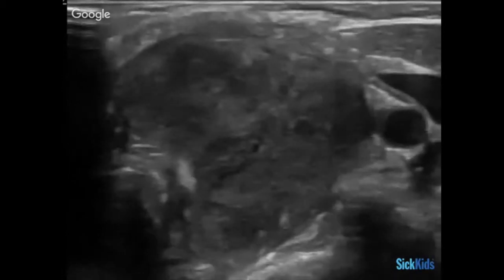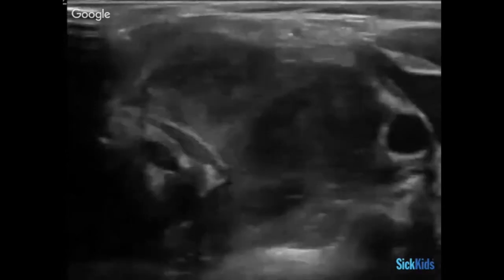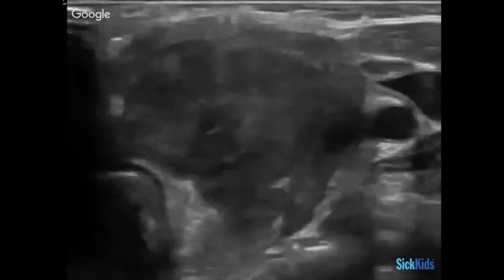So one of the things we probably don't do enough of is when we look at lymph nodes and we see that they're big, or if we see that they're necrotic and they're anywhere close to the vessel, we should scan the vessel for thrombus and Lemierre's, because there's a potential that it could be there. Now, it's a rare thing, but while you're there, you may as well check it out. It's like going to the grocery store and picking up some milk when you're getting cereal. You're there, so why not check it out?